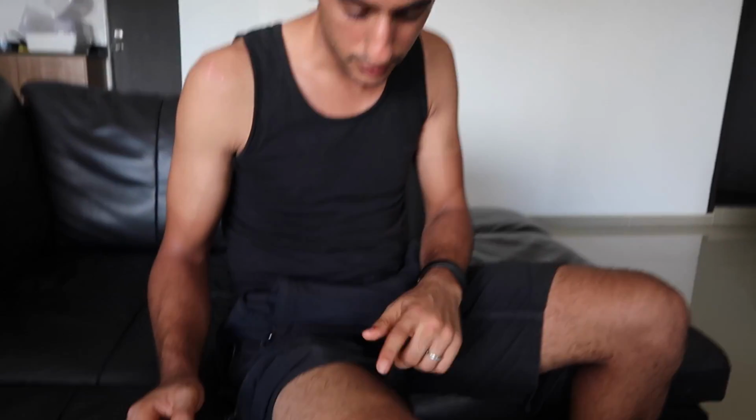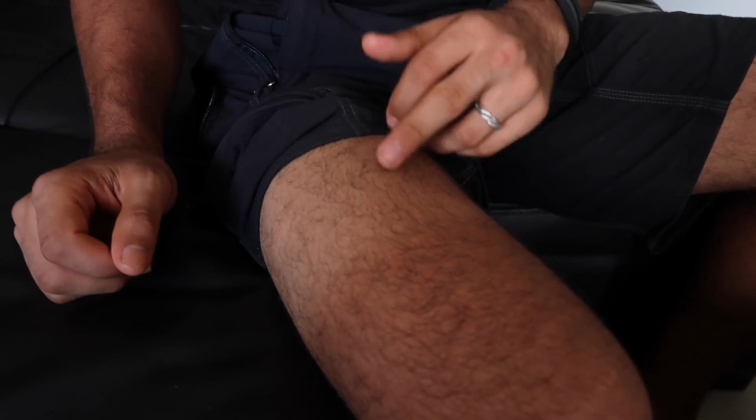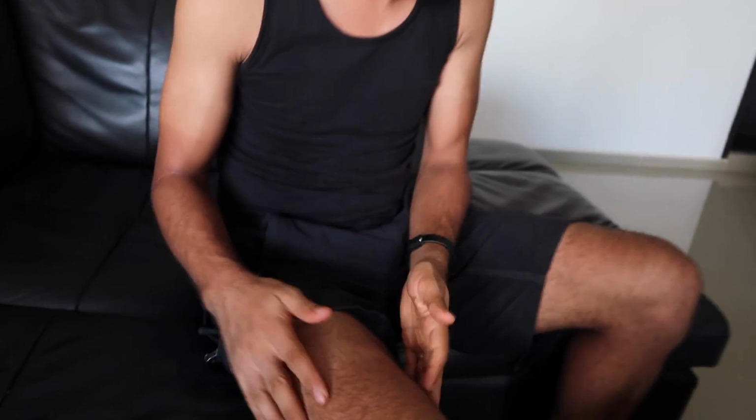But yeah, that is how you do a B12 shot. It's nice and painless. You can see a little bit might come through, a little bit of blood, but it's fine. And then just relax the muscle. It will kind of absorb into your bloodstream in no time.